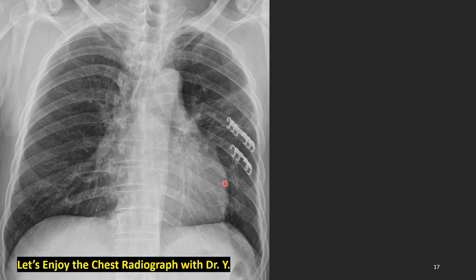What do we see here? The actual point is here: distal left main bronchus and upper lobe bronchus. But it is not clear with the chest radiograph only. We cannot tell anything about what's wrong here. We only know about these peripheral haziness with fibrosis. Let's look at the CT film.